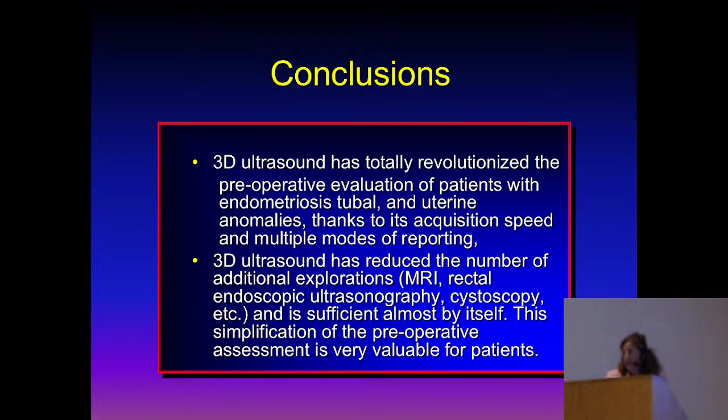And yes, you can diagnose endometriosis by ultrasound, even sometimes at lower stages, and that's one of the diseases that on average takes 8 years to diagnose. So we require that the GYN should have more experience in their ultrasound evaluation.